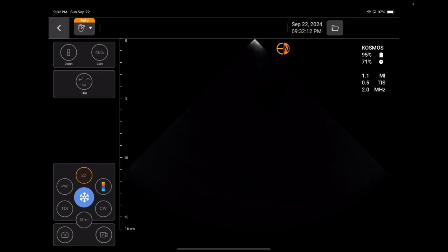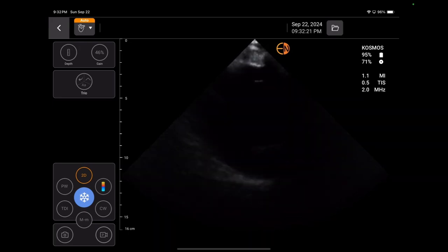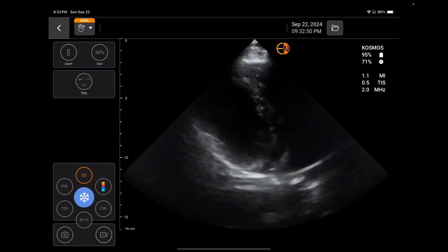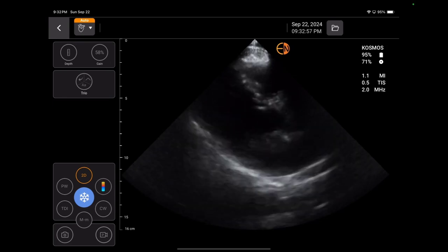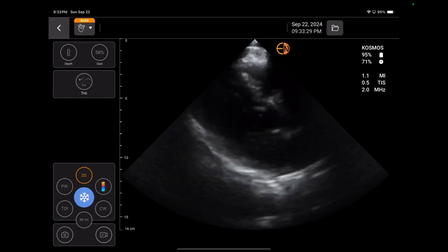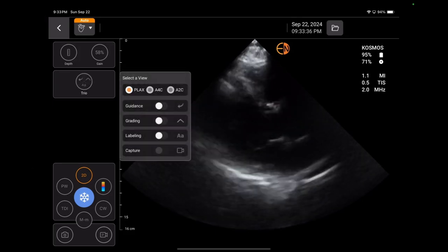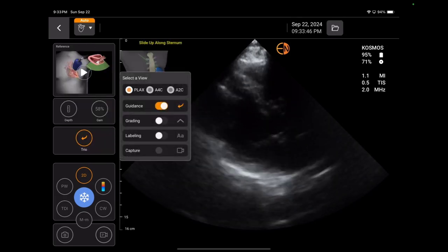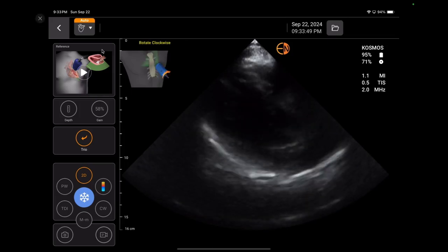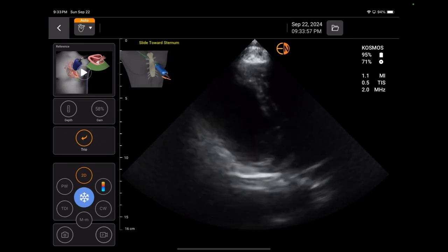I'm going to start with the parasternal long axis view — this is on myself. I don't have the greatest parasternal long axis while sitting here, but you can still see pretty well. If you tap on the trio button, that's where some of the AI guidance happens. You choose your parasternal long and you can turn on guidance. If I turn on guidance, it will tell me what I need to do — you can see in the left upper corner exactly what I need to do to get a better view. So if you're new to this, the artificial intelligence tells you exactly what to do.